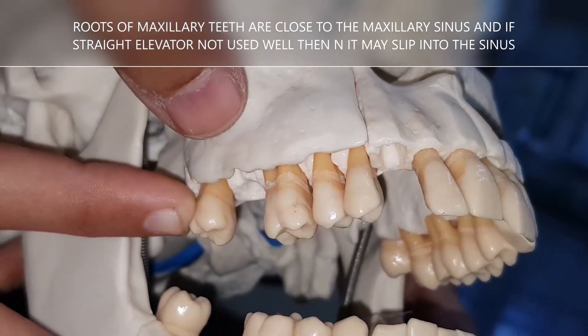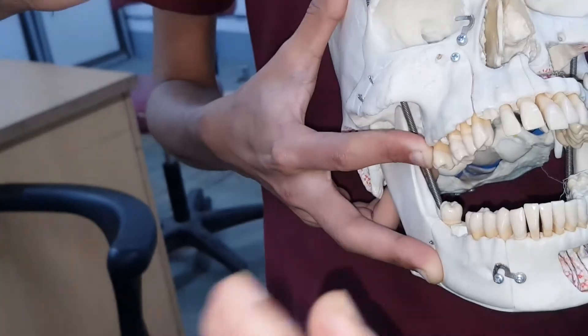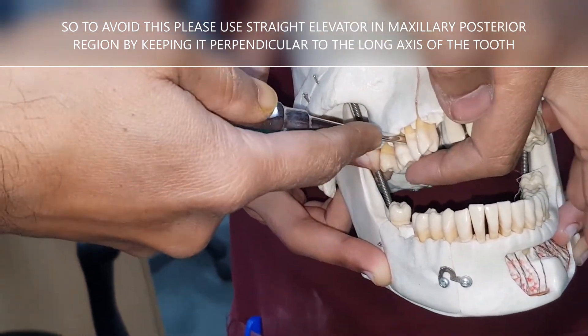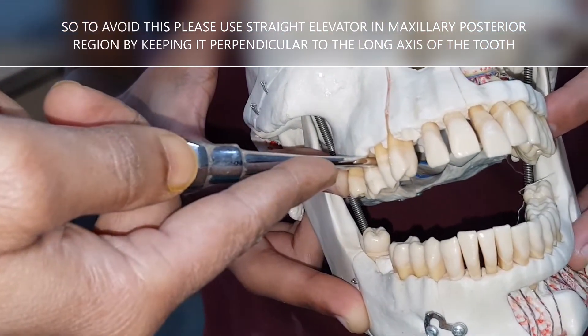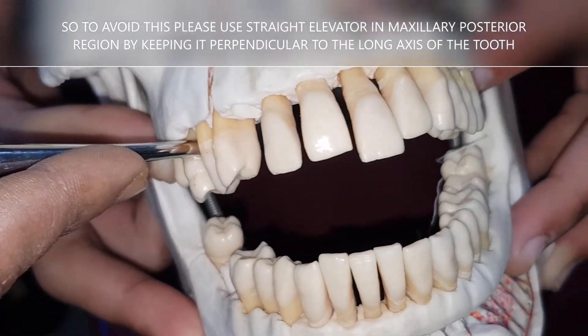To prevent this, in the maxillary posterior region always use the straight elevator in a perpendicular manner — perpendicular to the long axis of the tooth — in the interdental region. This is the safest way to use the straight elevator in the maxillary molar region.